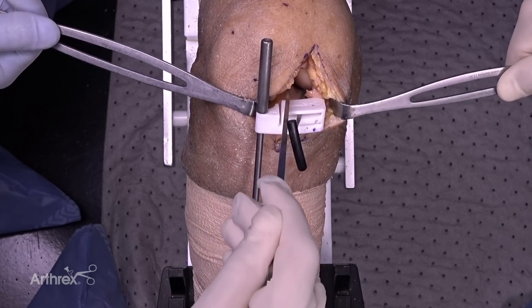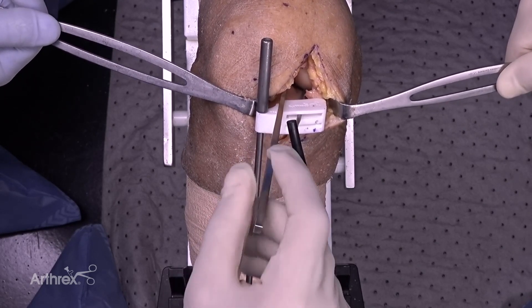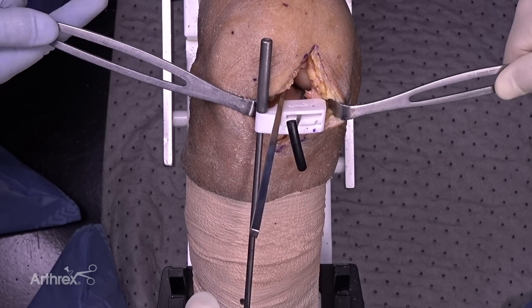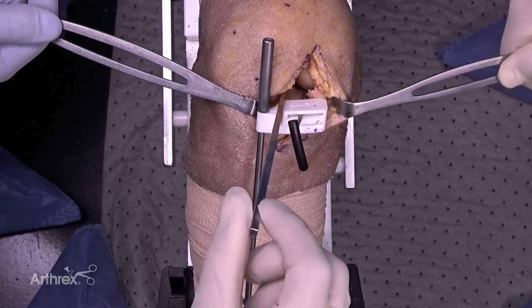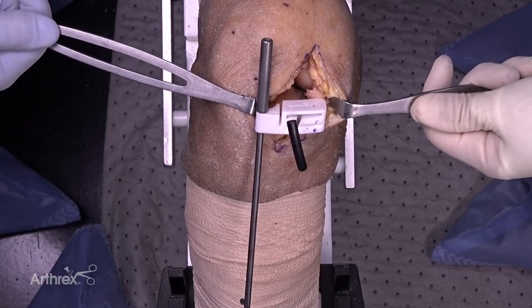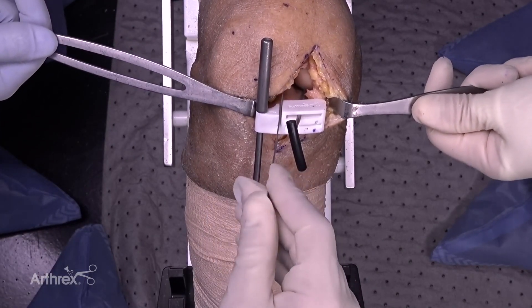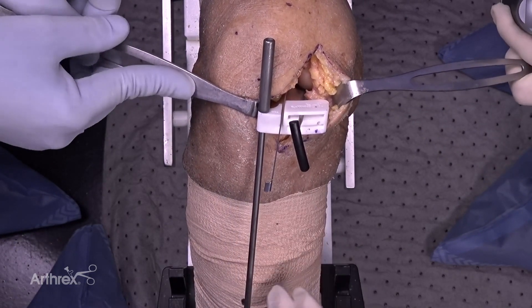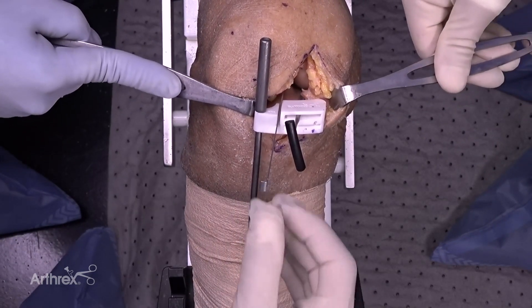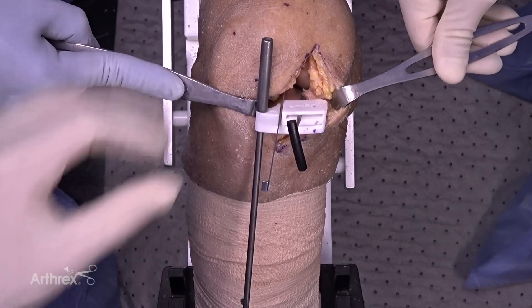I use an osteotome first, right on the bone, just to make sure soft tissue attachments are released so they don't tether my saw blade during the saw cut. That opens up a little area so I can take my ruler and set it in the vertical capture, right up against the lateral aspect of the condyle. That gives me my rotation and my position.